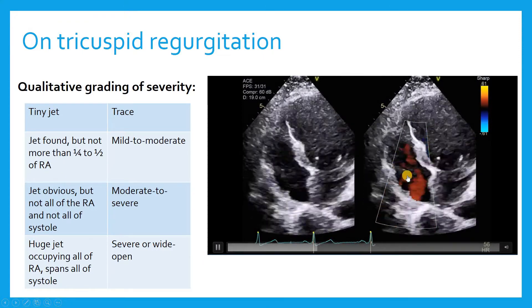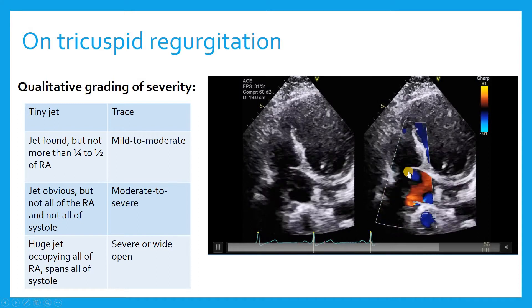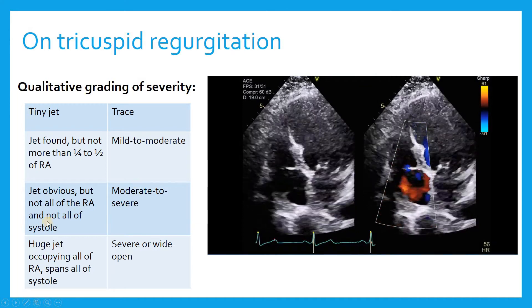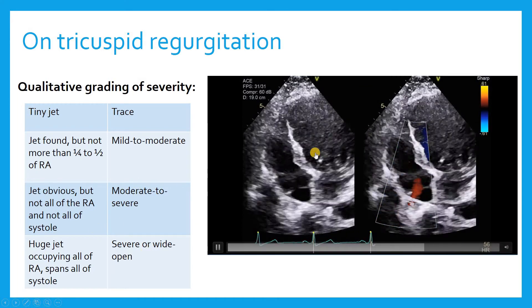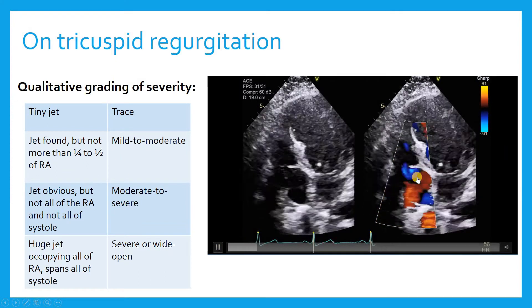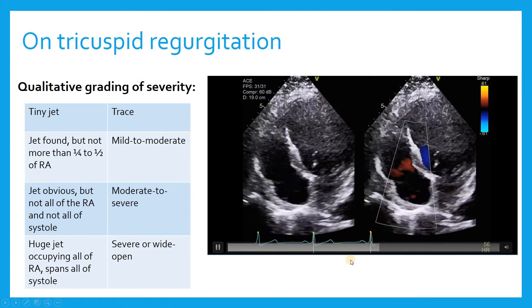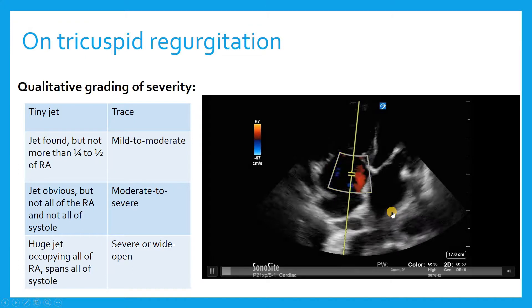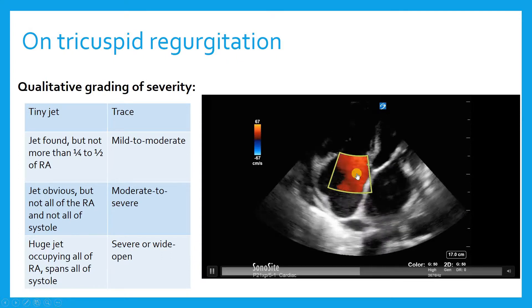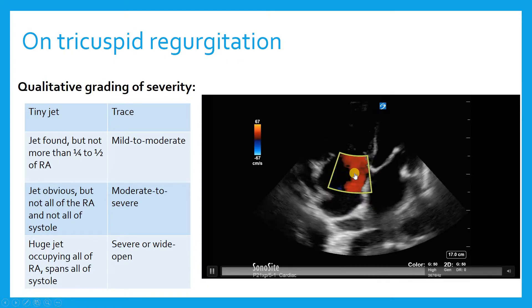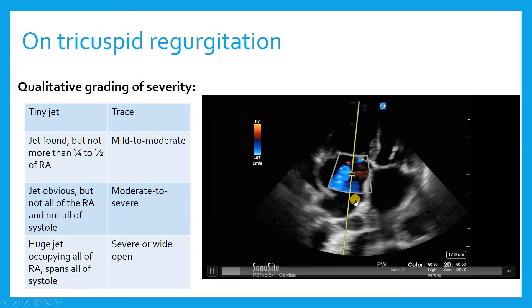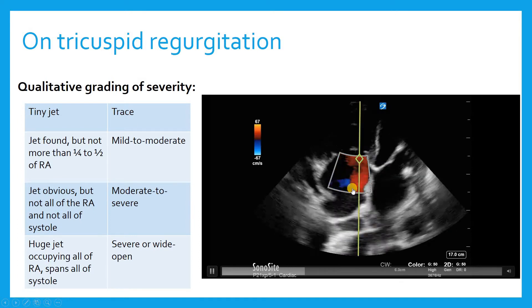Looking at this first example, the TR jet is actually readily visible, but it's not going to meet any criteria for moderate to severe. This would probably be trace to mild — certainly no more than an eighth of the right atrium. Contrast that to the second patient: when I first looked at it the jet didn't look very good, but with a different probe angle, this is now probably a moderate regurgitation signal occupying almost half the right atrium.